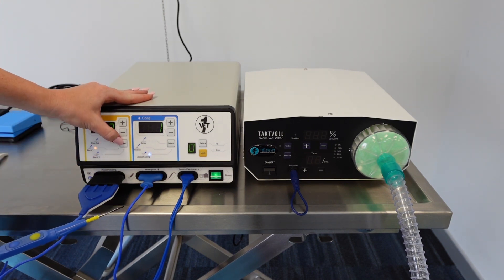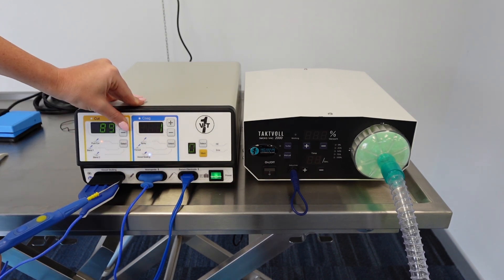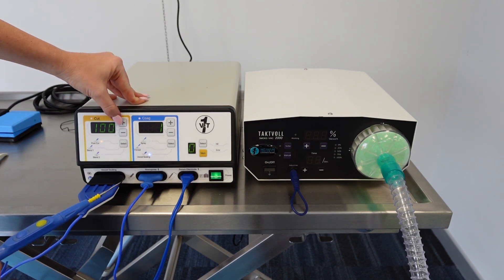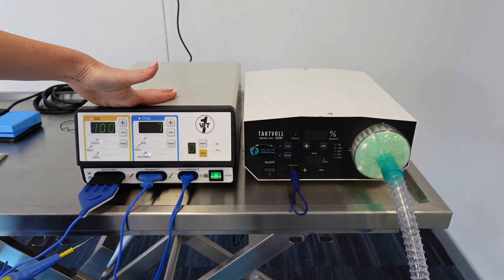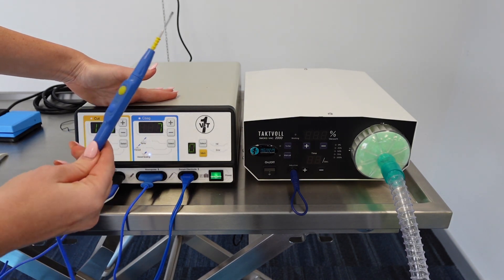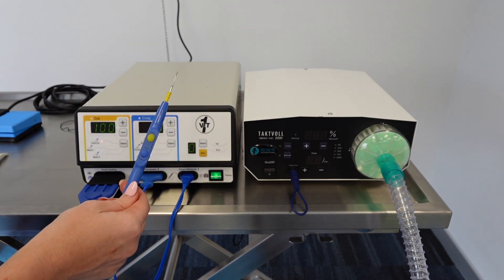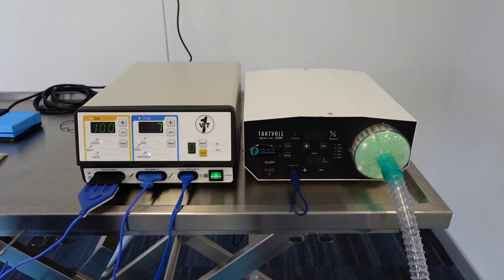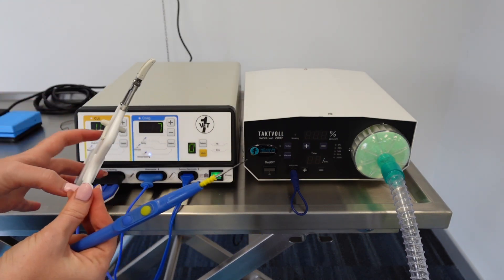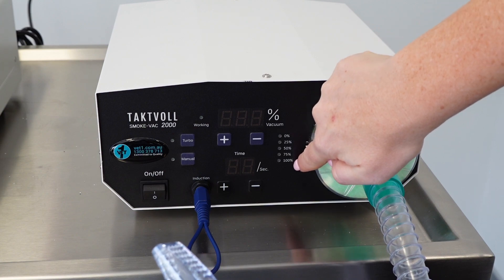You've got your cutting option and your coagulation option. The cutting option has three sub-options: pure cut, blend one, and blend two. Use the select button to cycle through which option you want, and use the plus and minus buttons at the top to adjust the power level up to 100%. The coagulation program also has three options: spray, forced, and vessel sealing. With spray and forced, you still use the cutting instrument from the monopolar attachment. However, if you're using the vessel sealing option, you need to use the vessel sealing attachment — the scissor-like instrument.